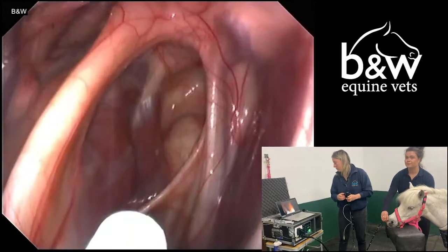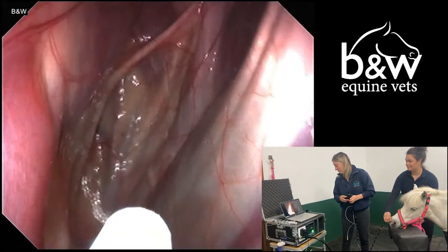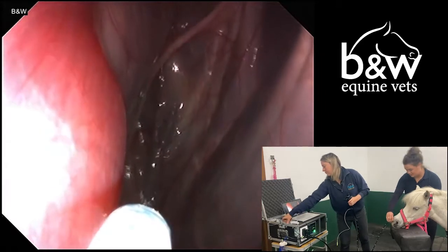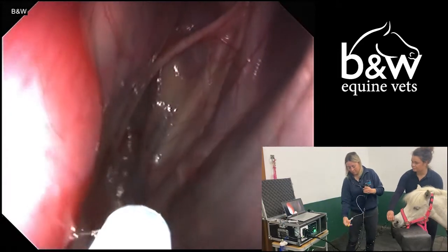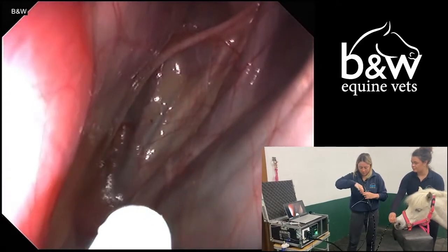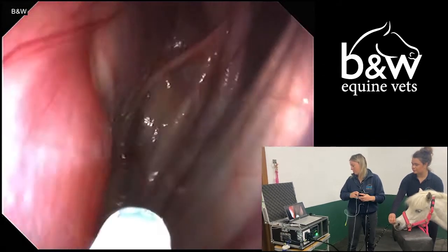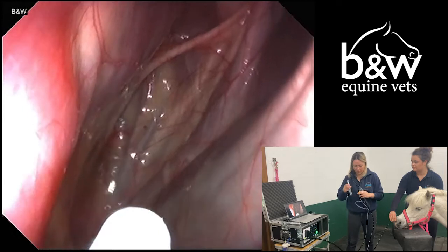It is important to check both sides of the guttural pouch for the presence of chondroids, which are calcified chunks of white blood cells and pus which can be present in a horse that has had strangles in the past. As you can see, this pouch is quite clear and we can't see any evidence of chondroids.